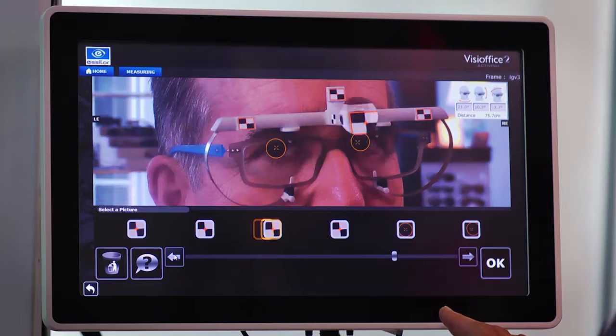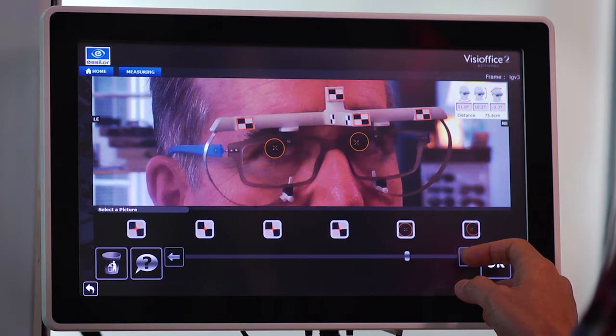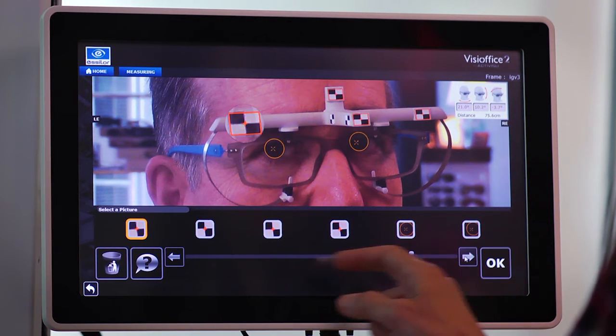Okay Bob, you can relax for a moment. Like before, toggle through these pictures until you find one where the four clip sensors are most clear and corneal reflections are properly detected. Then select the OK icon.